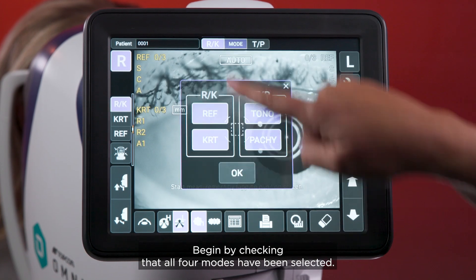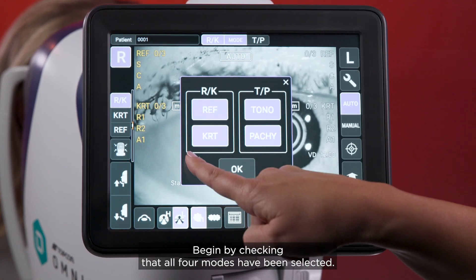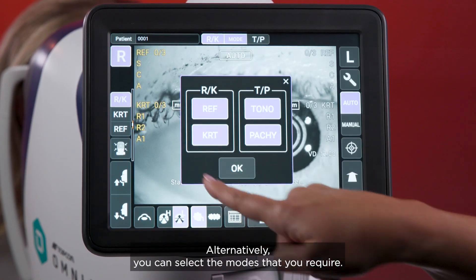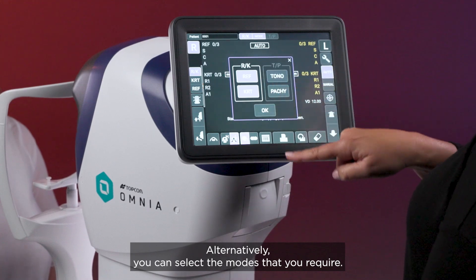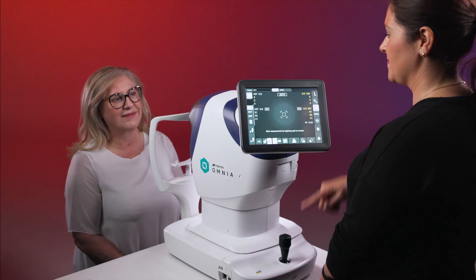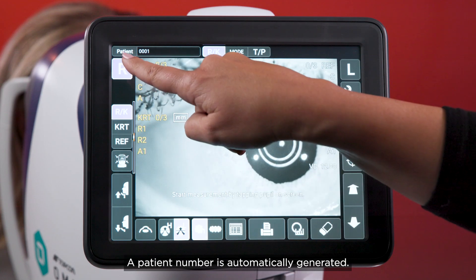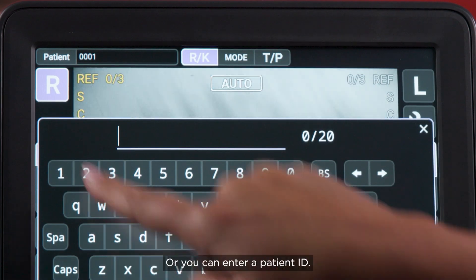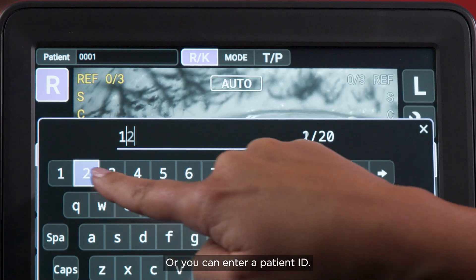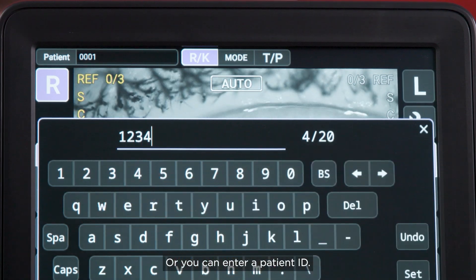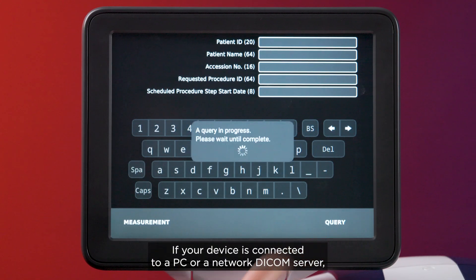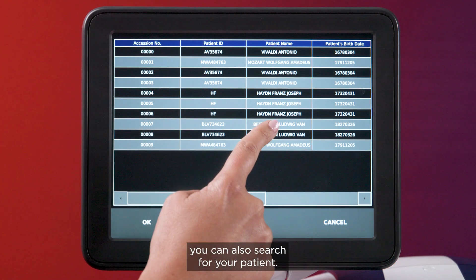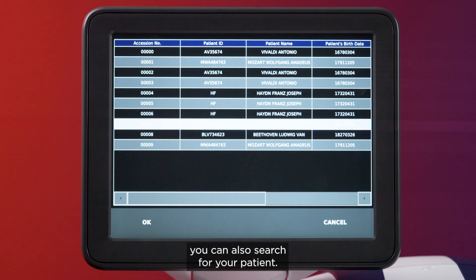Begin by checking that all four modes have been selected. Alternatively, you can select the modes that you require. A patient number is automatically generated, or you can enter a patient ID. If your device is connected to a PC or a networked ICOM server, you can also search for your patient.